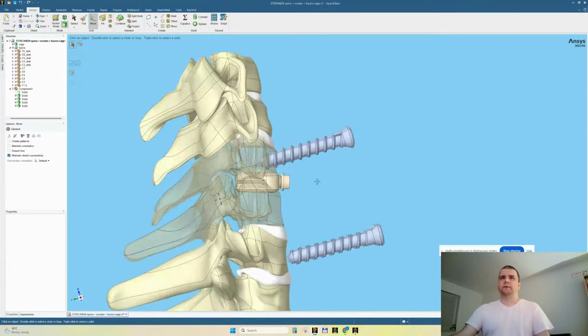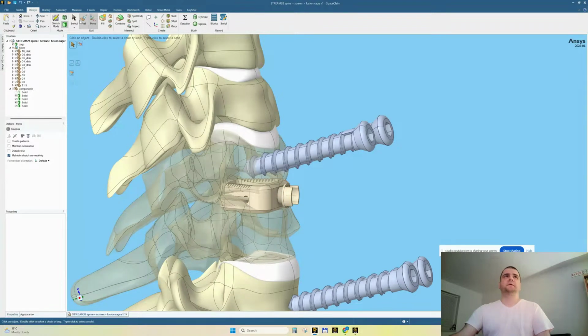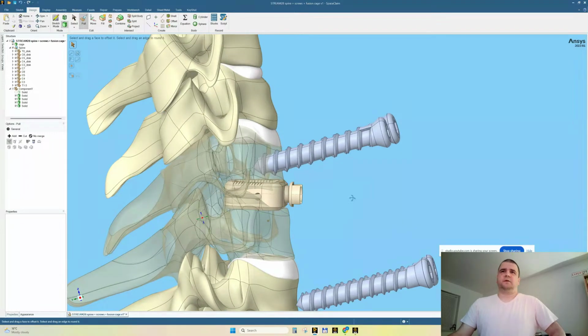We can scale this down another maybe 0.85. I'm sorry for not having the proper dimensions. Yes, these are parts taken from grabcad.com. I didn't model them. I don't know who made them. All my thanks to the original authors, but I need to adapt them because these are not up to specs or the dimensions. They were very big, so they were not realistic.